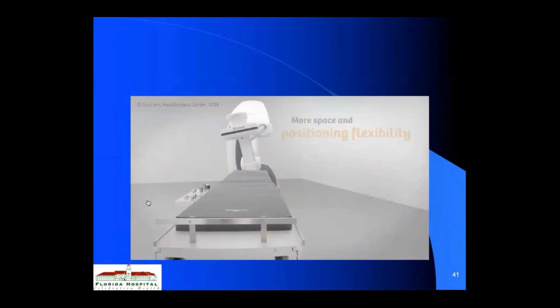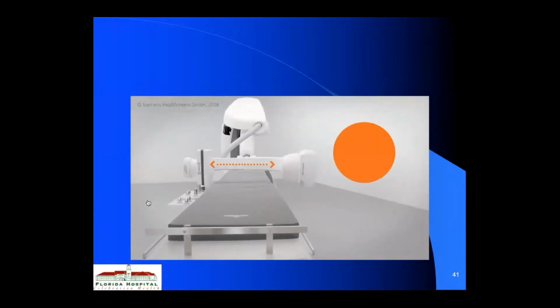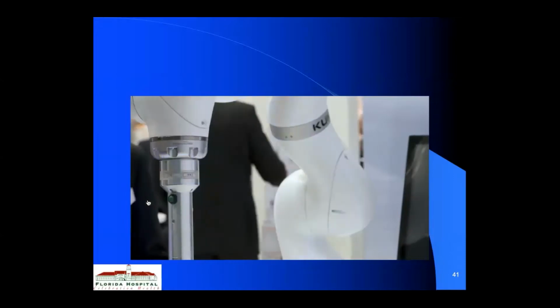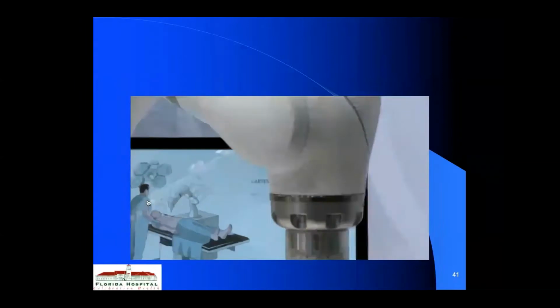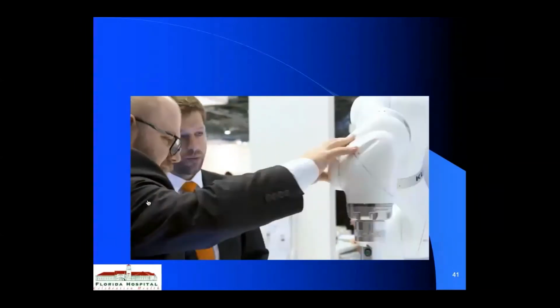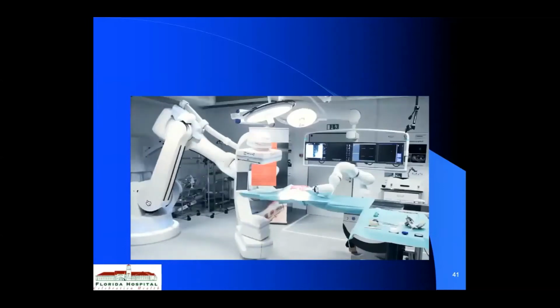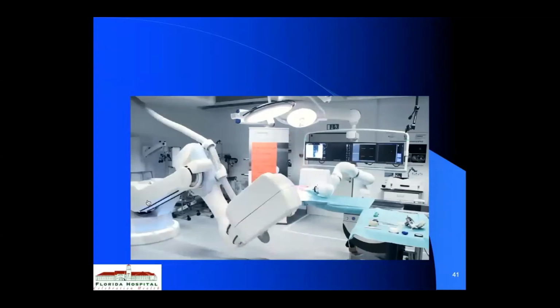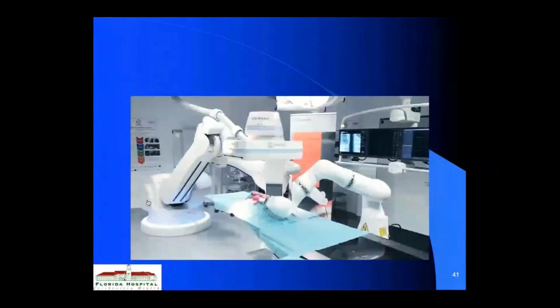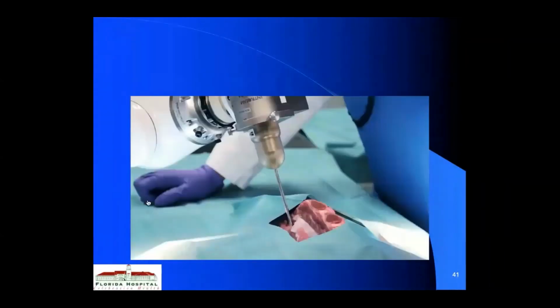where you can take the real-time acquired image, whether it be with CT, 64-slice CT in this situation, ultrasound, or MRIs, taking that radiologic data, putting it into these robotic arms, gathering the tumor coordinates, and probably limiting the kind of resection margins that we need when it comes to cancer surgery to just taking out the bad area and leaving behind all the good tissue.